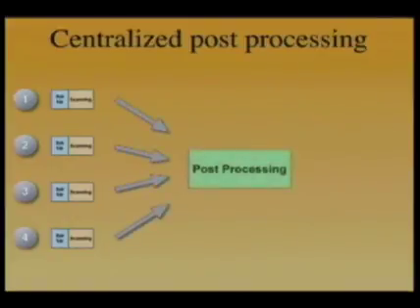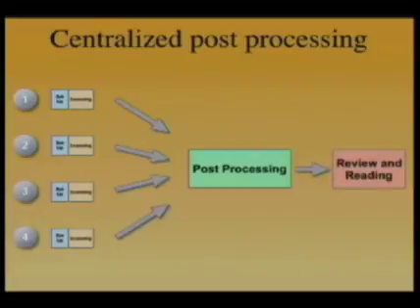And then you take all those 3D data sets and you send them to a central place, much like the 3D imaging lab we've set up for CT in our department, where all the post-processing is done by one or more individuals who are trained to do that. And then the post-processed images are provided to radiologists for review and reading.